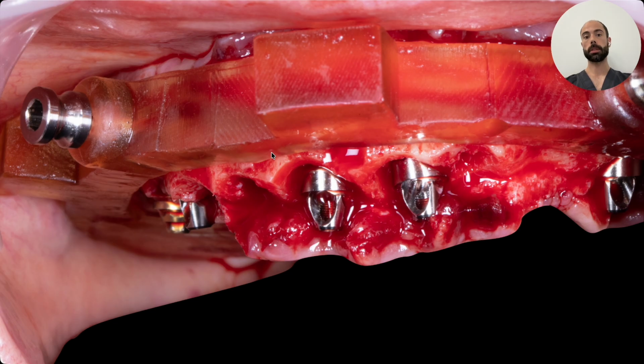In full arch FP1 rehabilitation, the pink-free protocol, the soft tissue has to do everything that the pink ceramic or acrylic would do in an FP3 case. There's no flange, no artificial gingiva. The mucosa is the gingiva. So if you don't have volume, you get black triangles. And if you don't have keratinized tissue, you get recessions and maintenance problems. And if you don't manage the contour of your provisional correctly, the graft has no space to mature.